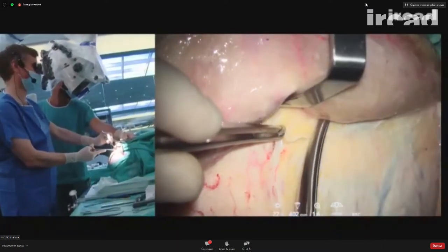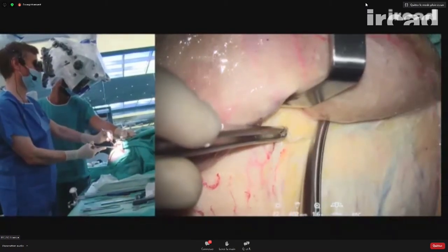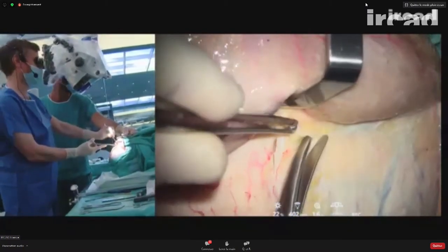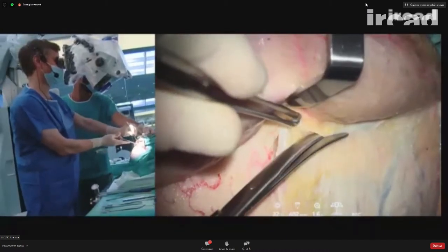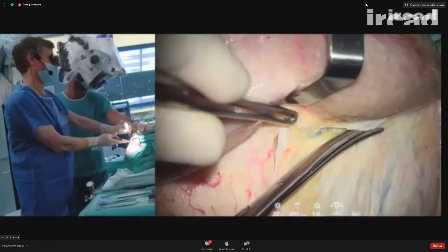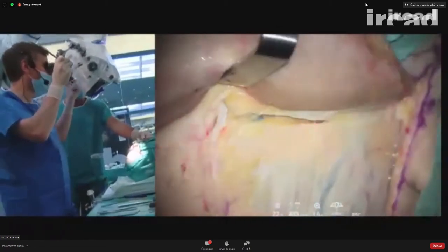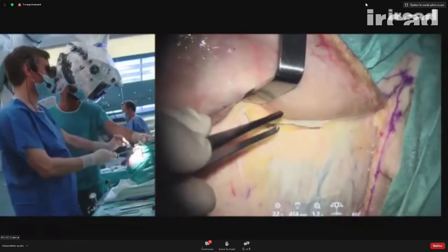The space I should not work in is this one, because if I keep going here, I will meet the frontal branch. So I have to go deeper and cut the superficial fascia here, all the way down.